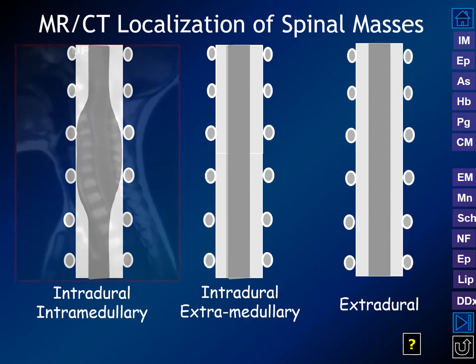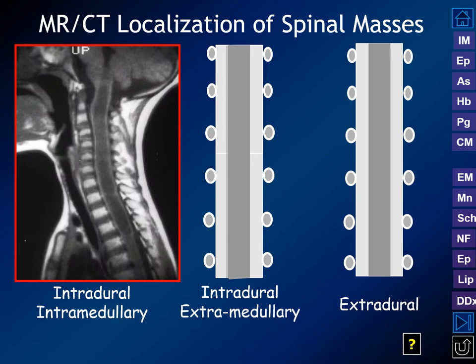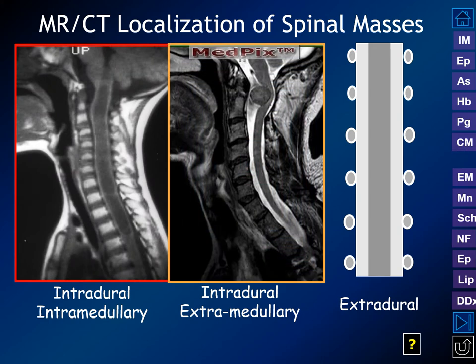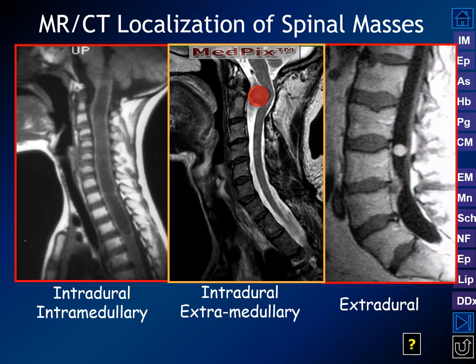We still have expansion of the cord illustrated on MR, and displacement of the subarachnoid space, which on T2 is going to be bright white. On MR we can also see a herniated disc compressing the thecal sac below the level of the spinal cord at the level of the lumbar spine.